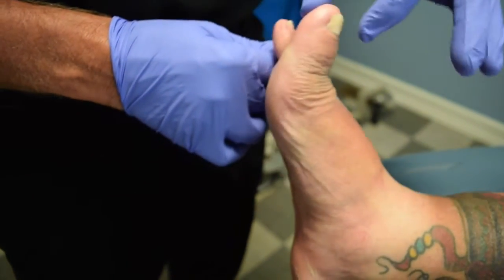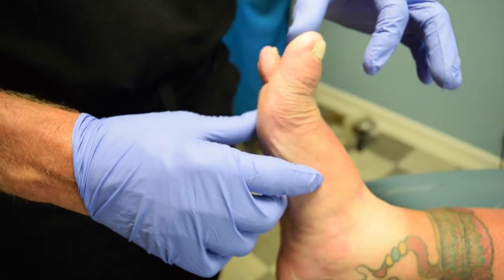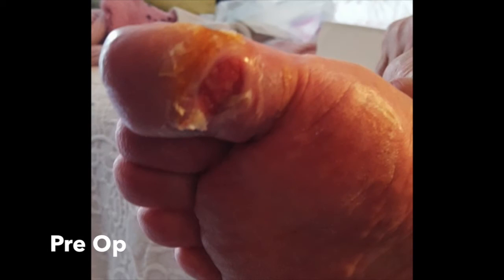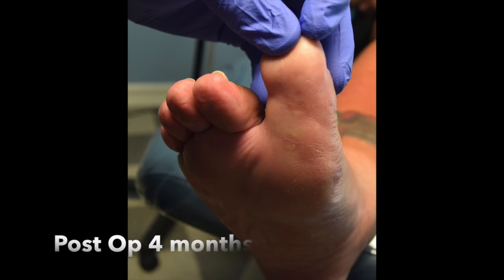Now she gets appropriate dorsiflexion with the toe and the pressure is off, so the ulcer should dissolve. We were able to use the Aiken Osteotomy, slightly modified, to not only wedge the bone so that it takes the toe up and takes pressure off the plantar aspect.